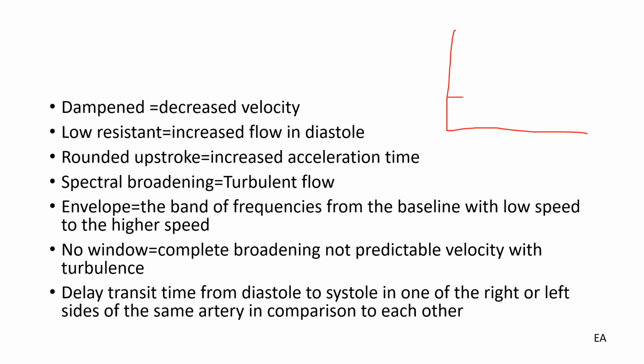So high diastolic flow, very long acceleration time, a round peak, and then it comes back to the diastole, high diastole. There is no dicrotic notch. Absolutely, the dicrotic notch is not here.